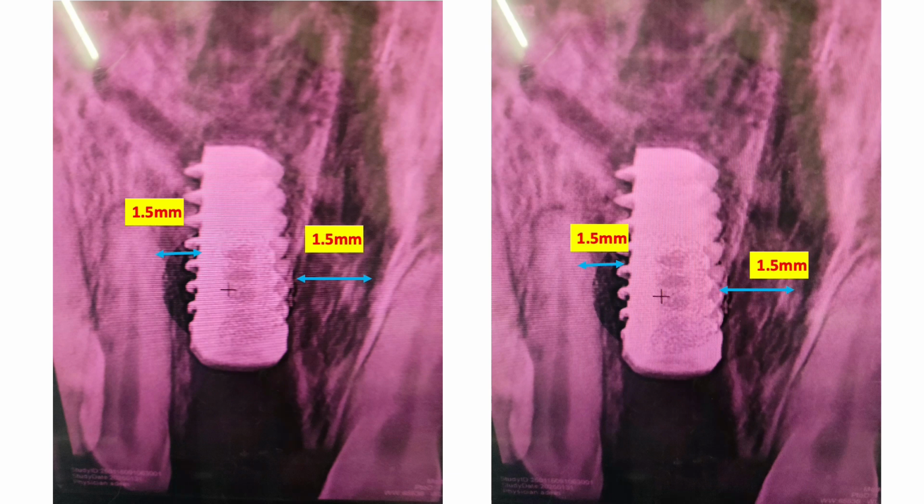Second, we have to engage the palatal or apical bone, not the facial, because facial bone is very thin. If you try to engage facial bone, there is a chance of dehiscence of the implant and again implant failure. And the third point is to remember the angulation. Maxillary anteriors have a 5 to 10 degree angulation. If you don't follow the angulation, aesthetics will be compromised.